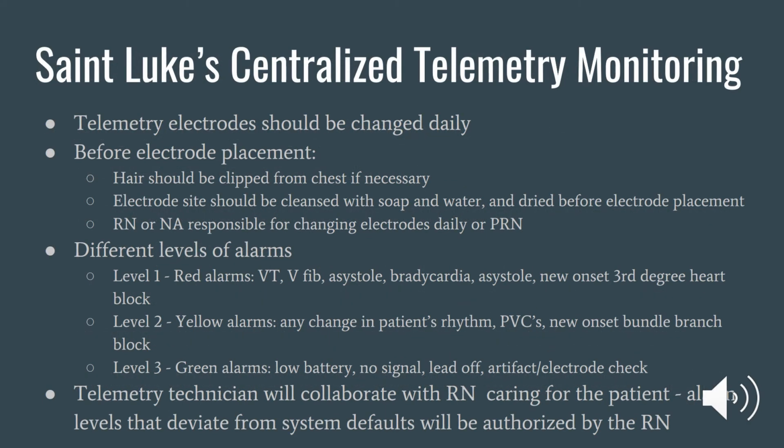The St. Luke's centralized telemetry monitoring policy states that telemetry electrodes should be changed daily. Before electrode placement, hair should be clipped from chest if necessary, and electrode sites should be cleansed with soap and water and dried before electrode placement.